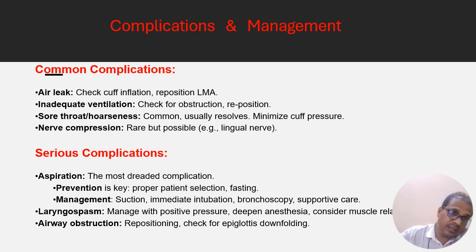There is also a chance of laryngospasm. In case of laryngospasm, we will deepen the patient, with positive pressure ventilation and proper oxygenation.